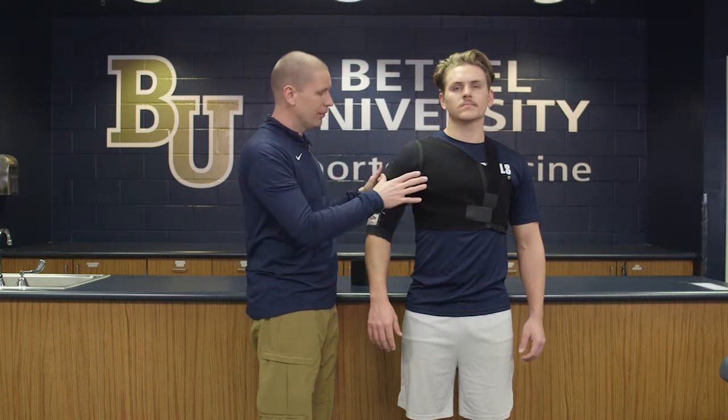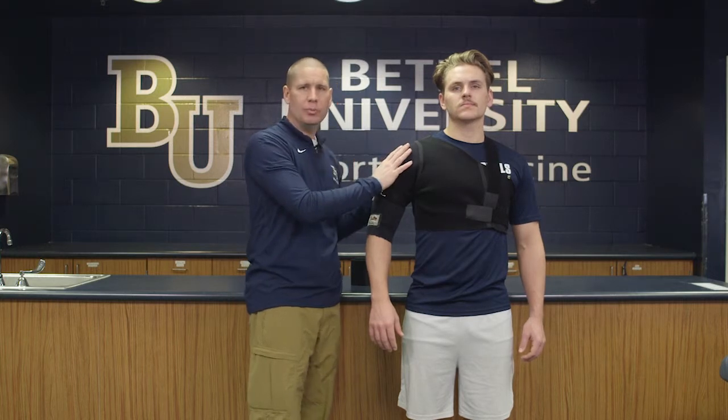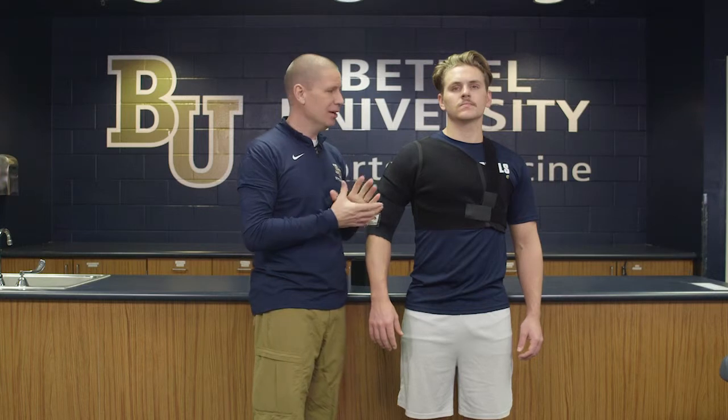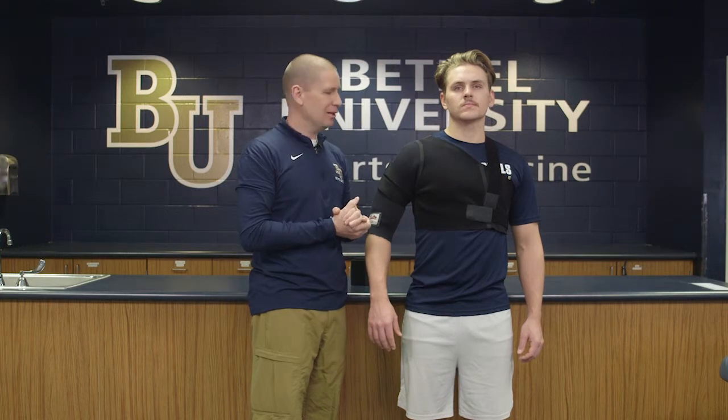There's a variety of different things you can do — you can protect against abduction, posterior instability, or multi-directional instability. You would just look at the directions to see how to apply the different straps for whatever condition you want to treat. Overall, it's a highly functional and useful brace to treat any type of shoulder issue you might find.